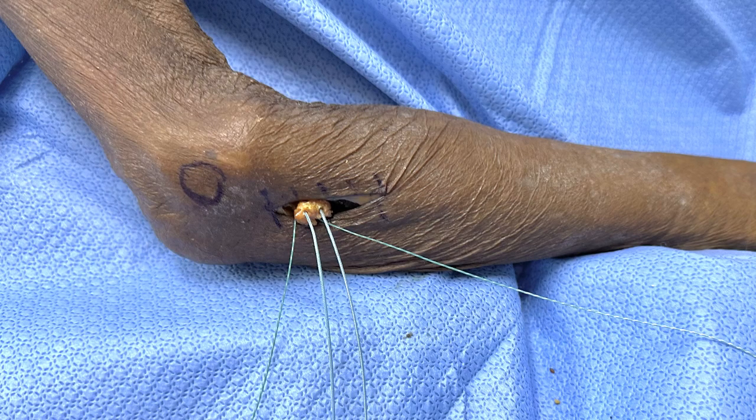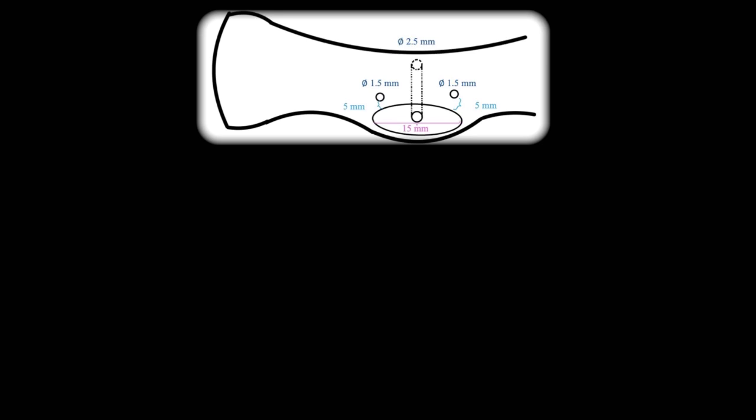The tendon stump is then passed through the created passage and out to the dorsal lateral skin incision. The short head proximally stays medial to the long head biceps. Make sure that after passing the tendon, the short head biceps tendon stays distal to the long head biceps tendon. Next, prepare the bone footprint for the distal biceps tendon at the radial tuberosity.